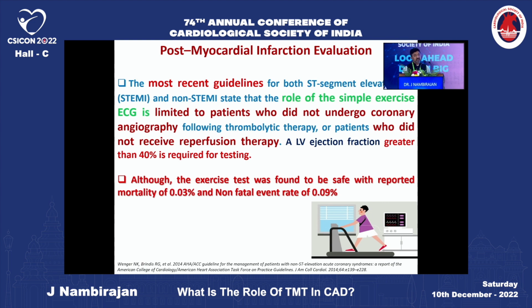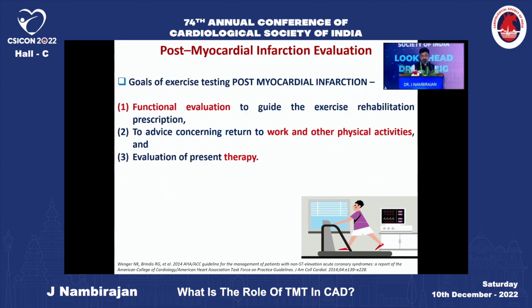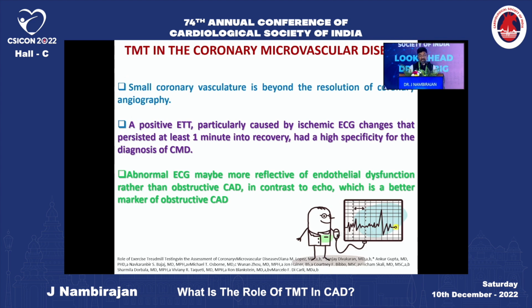It subjects them to repeated, unnecessary revascularizations in the post-MI setting. So, if at all it is used, it can be for functional evaluation, work and other physical activities, and evaluation of the present therapy. So, the TMT has gone beyond the routine, and nowadays it is used in detecting CMD, coronary microvascular disease.